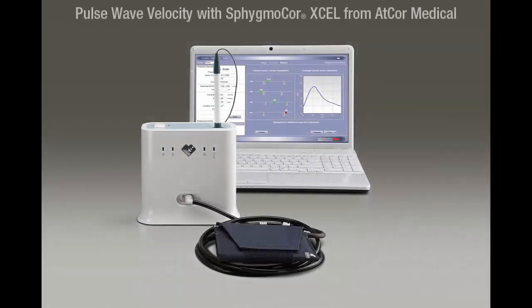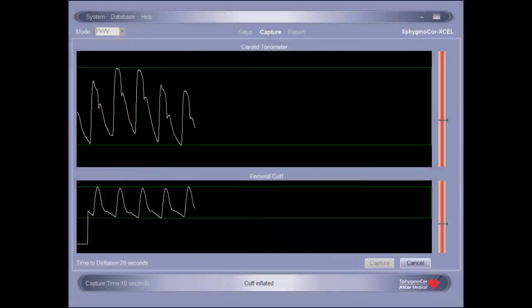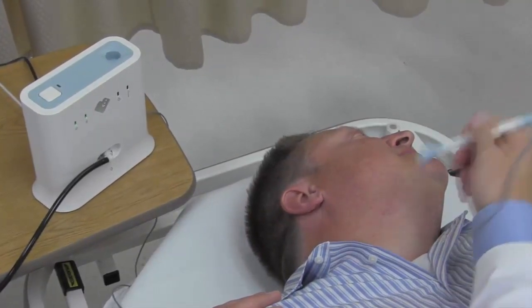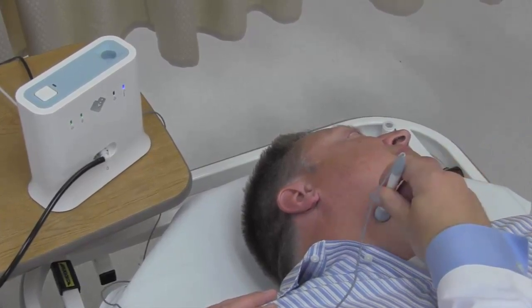Welcome to the SphygmoCor XCEL pulse wave velocity tutorial. This video will familiarize you with the operation of the SphygmoCor XCEL system and how to properly conduct a pulse wave velocity assessment. This tutorial does not cover system setup. If assistance with system setup is needed, please consult your operator's manual.